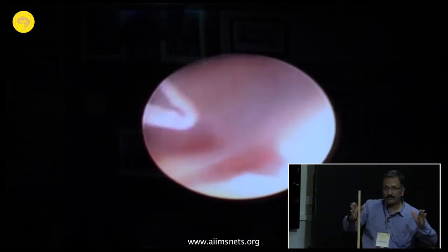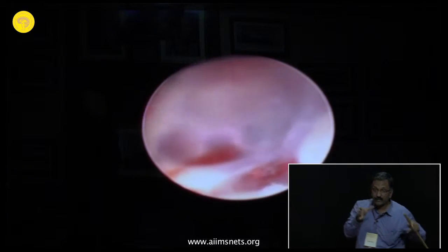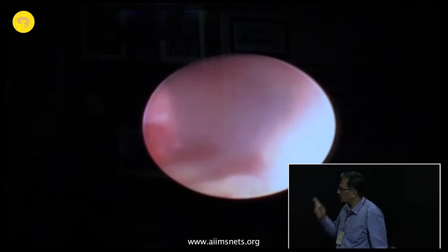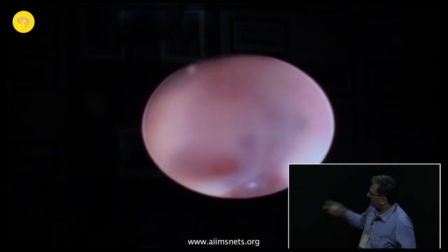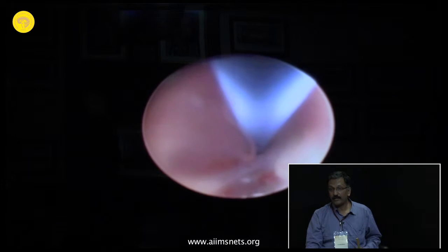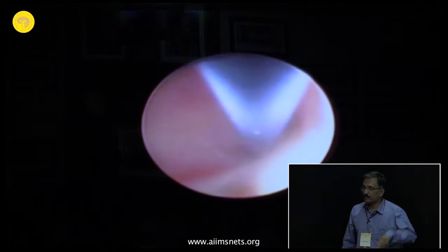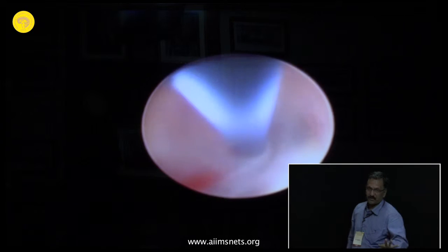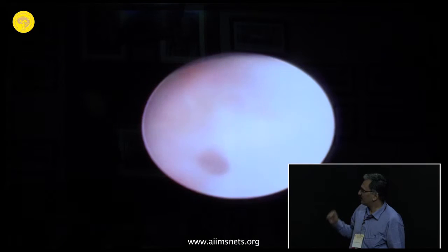So sometimes in ventriculitis, you might say, oh, it's all hazy, you're not getting the landmarks. Just have patience, go slowly, make sure that you're irrigating well, and you will get to the point where you can actually do a puncture. And the interesting thing is, once you puncture it, you will find that the CSF cisterns below that point are absolutely clear. So sometimes there will be ventriculitis because of a shunt infection, but below that, you will find the CSF is absolutely clear. It's a good option. It's not that, okay, this ventriculitis, you won't be able to do it. It's not like that. You just try.